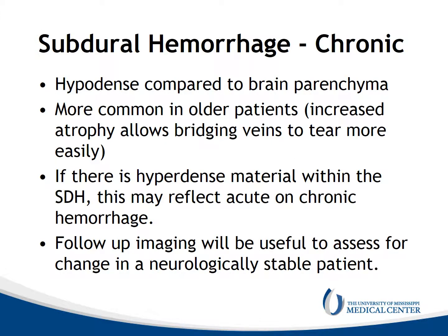Chronic subdural hematomas are hypodense compared to brain parenchyma. They're more common in older patients where increased atrophy allows the bridging veins to tear more easily. If there is hyperdense material within the subdural, this may reflect that it's acute on chronic, and you'd want to do follow-up imaging to assess for change if the patient is neurologically stable and doesn't need to immediately go to the operating room.